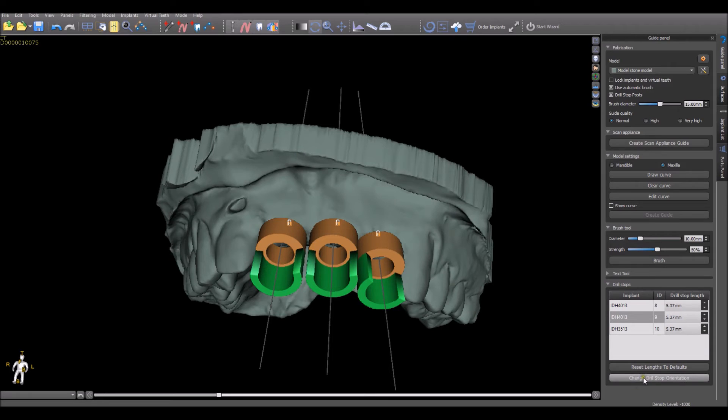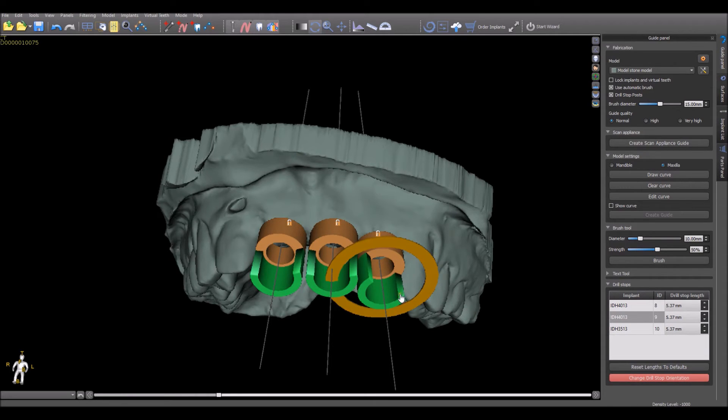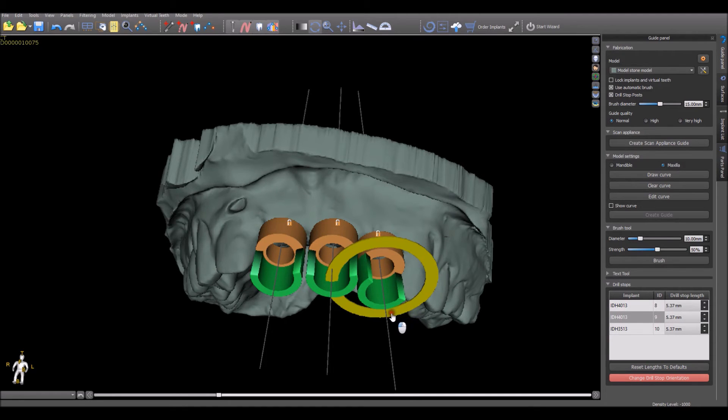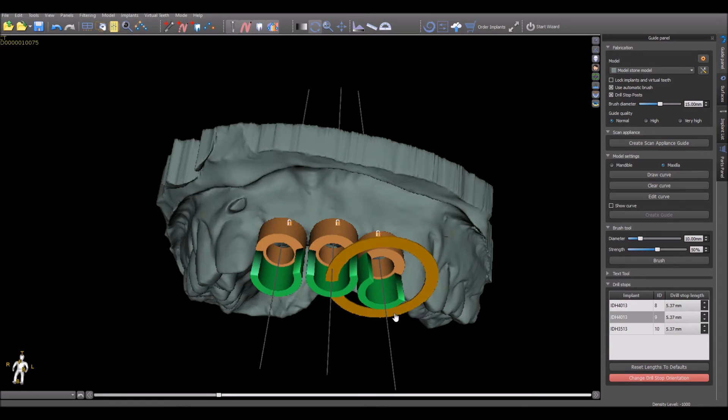Pressing Change Drill Stop Orientation and clicking on a drill stop or hovering over it will allow the user to grab the orange circle that appears and change the orientation of the opening for the built-in drill stop. By default, the drill stop is oriented towards the buccal side so that the drill can be inserted from the side of the opening.